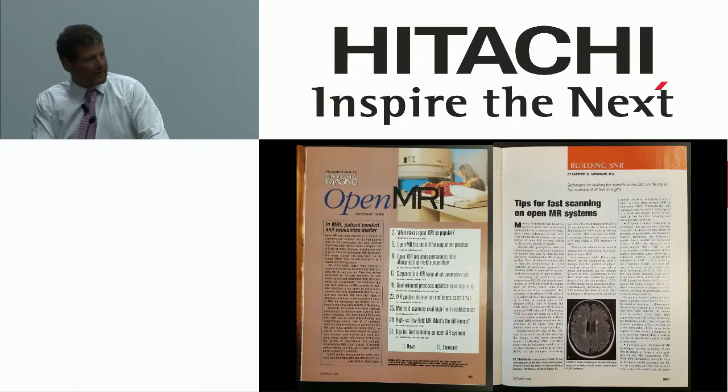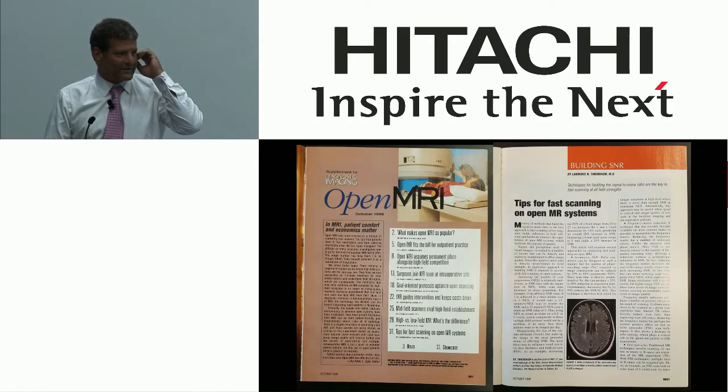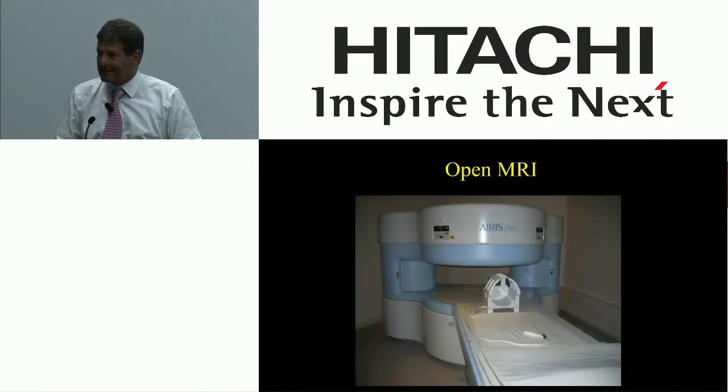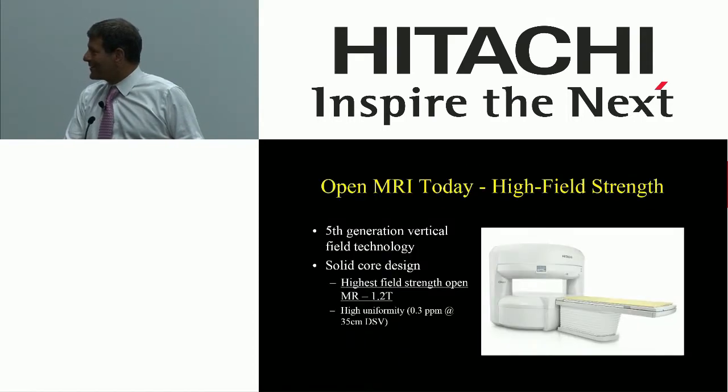Now, mind you, we cared about patients. We offered this type of technology, but the challenges were great, and no one would pretend that you could match the same quality as a high field exam. These types of machines were pioneers, they were patient focused, and frankly, we believe in that as an organization, but they created challenges that few could overcome.